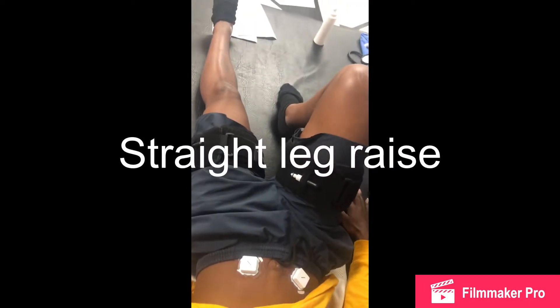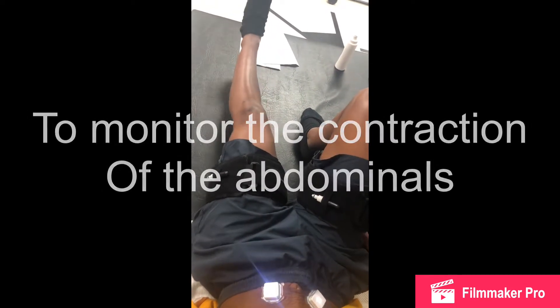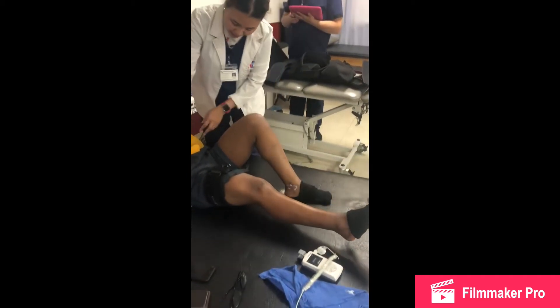We're doing blood flow restriction technique to activate the muscles on the abdominal area. We're also using a portable EMG to monitor the contraction of the abdominal area. She's doing really good. We have our portable EMG to monitor the muscles of the abdominal area.